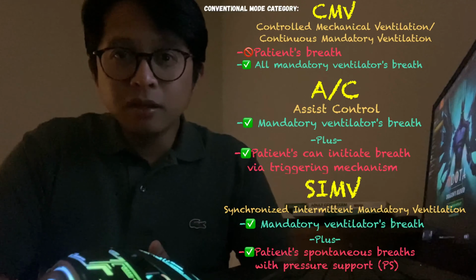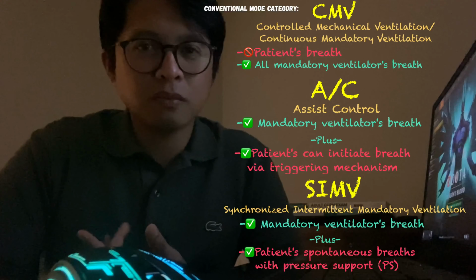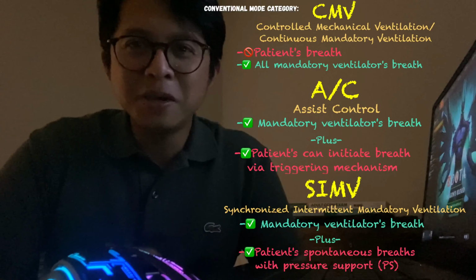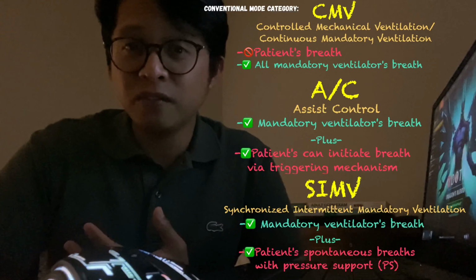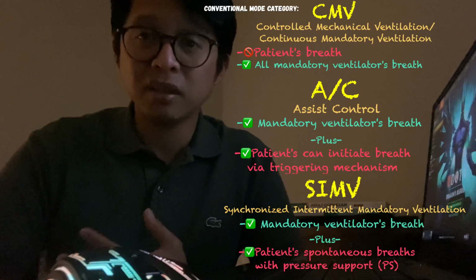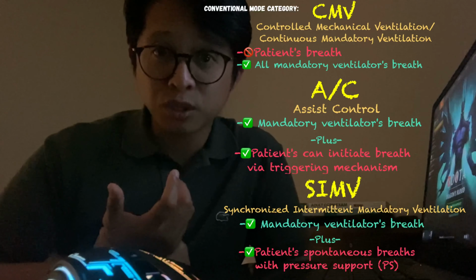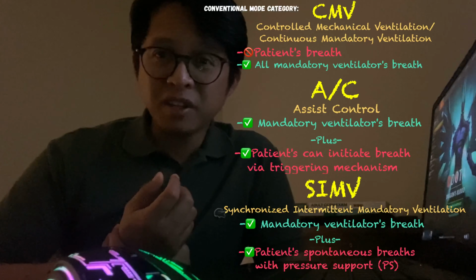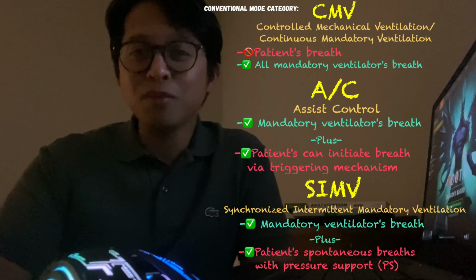Is the mode suitable for the patient? Come to think of it, for me, the patient is the same as having a VC-CMV mode because he is sedated and paralyzed. He cannot trigger nor give any spontaneous breathing. The breath he's taking is the mandatory preset breath of the SIMV mode.